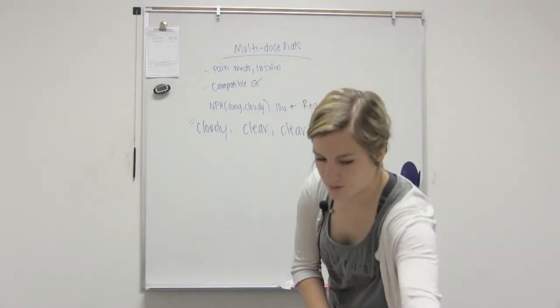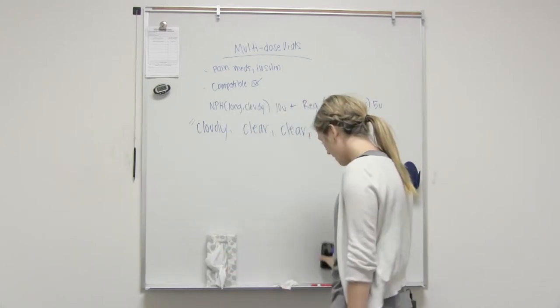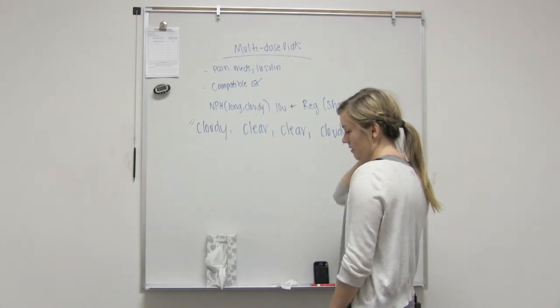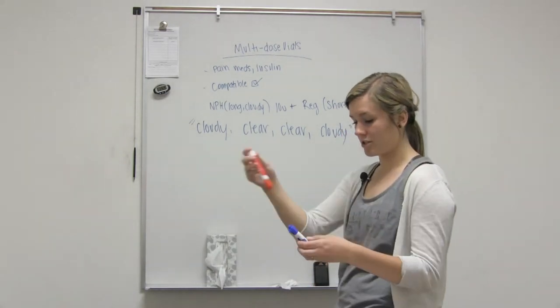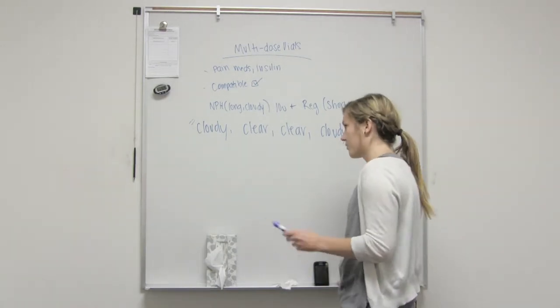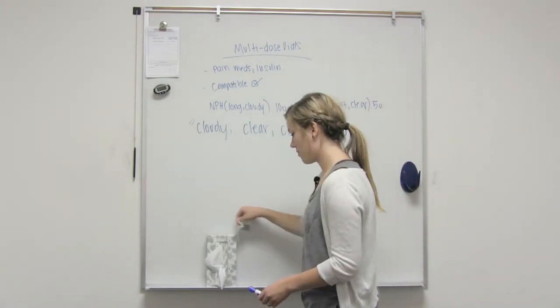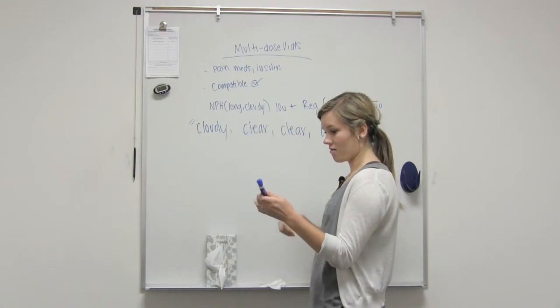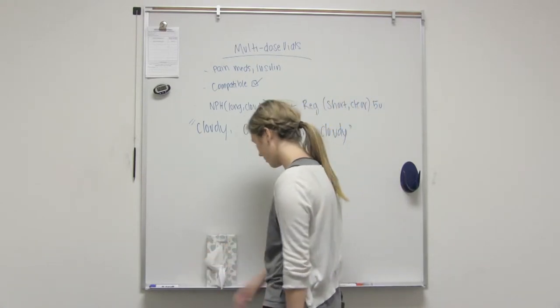We're going to use these two things. This is the NPH vial, and this is the regular vial. First things first, you take your two needles. You can either do what Sister showed you when she just injected them into each other. Sometimes you're just going to do this, though. This is what we did in competency. You clean the stopper on the top. You draw up 10 units of air, for NPH, and inject 10 units of air into NPH, take it out, put it over there.